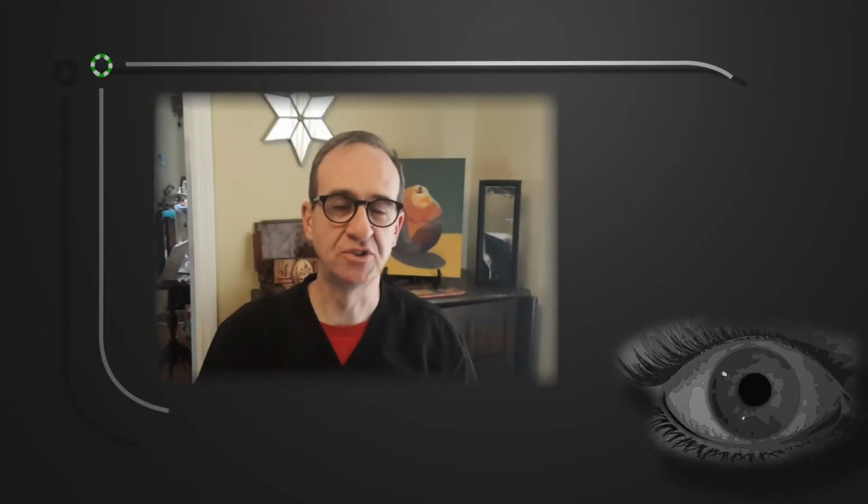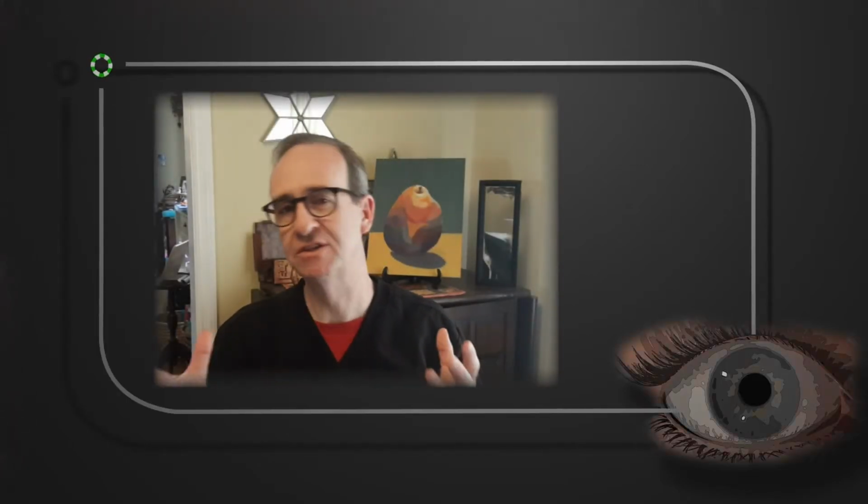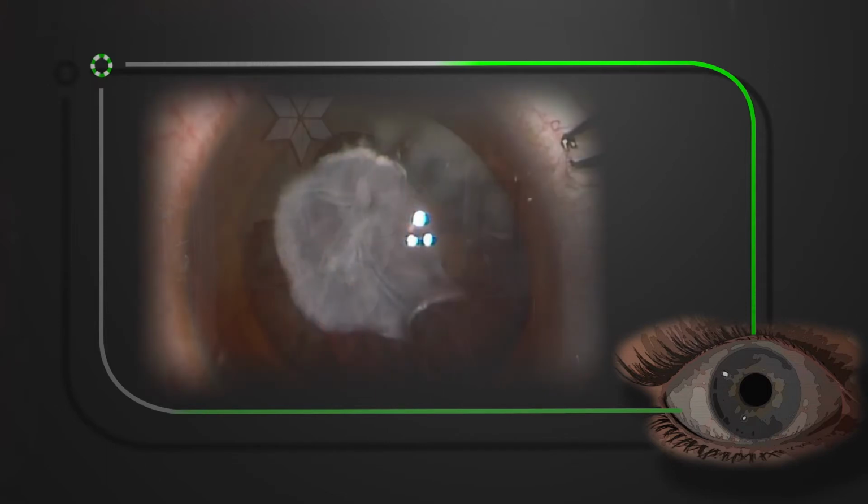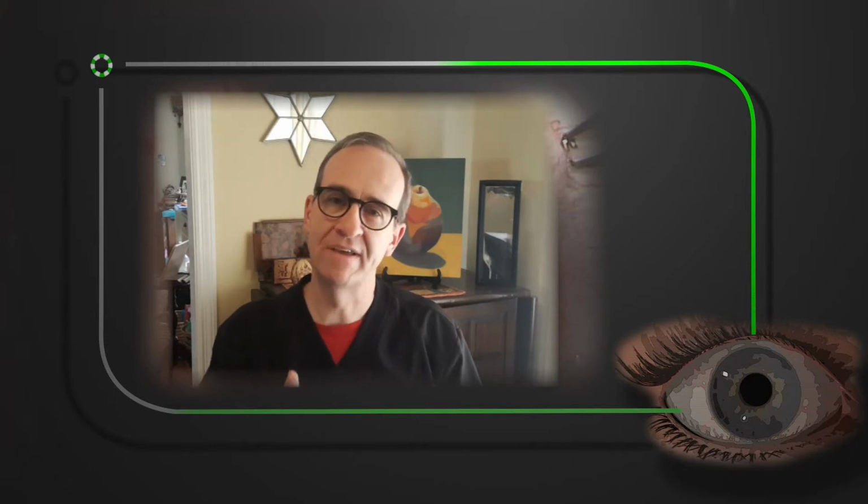A typical cataract surgery is pretty routine. The steps are pretty much the same from surgery to surgery. Every now and then, though, cases come in that are different and complex, and I definitely noticed that when I was beginning this case. It had a very difficult capsulorhexis, and it was doable, but we had to sort of pause. I recall very much at the beginning of this case deciding where the incisions are going to go and how we're going to open the capsule.